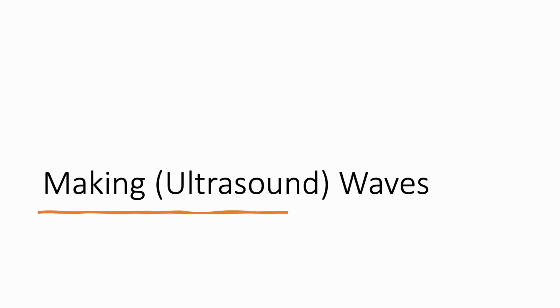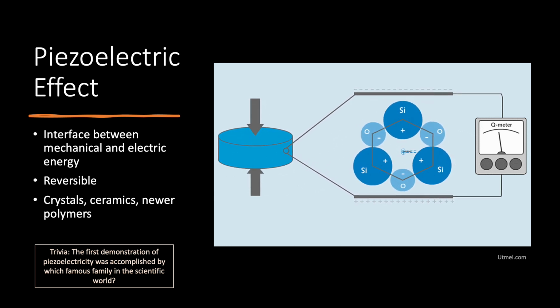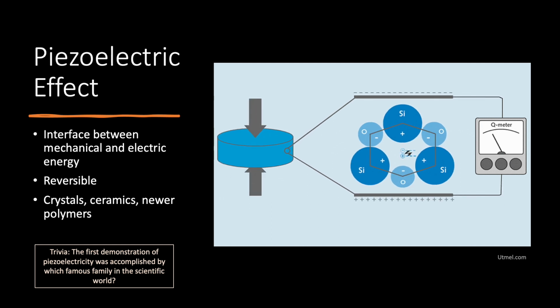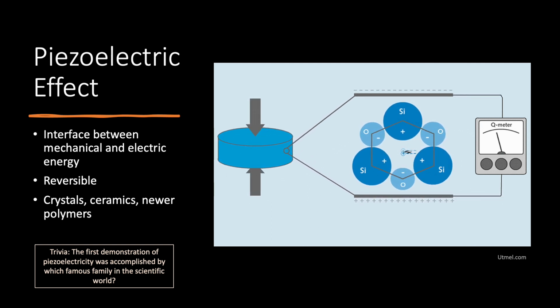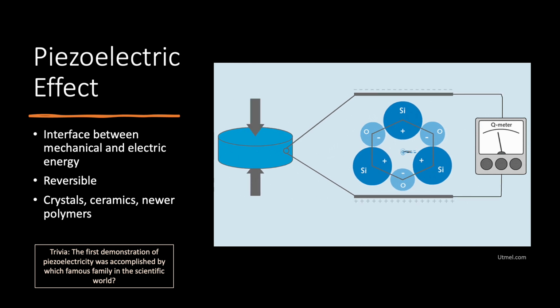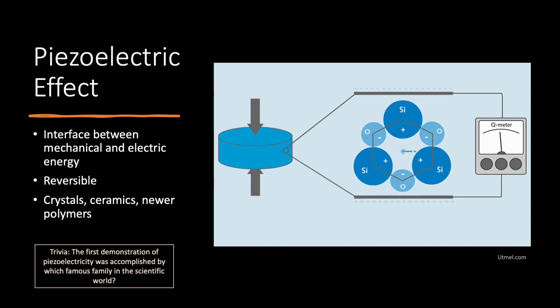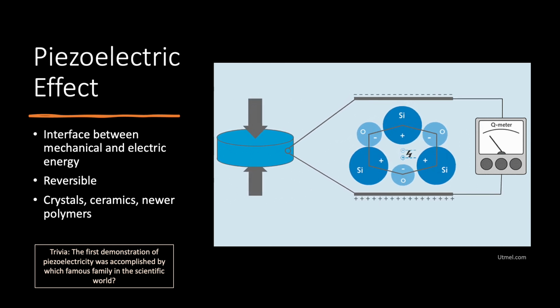All right, so first, let's talk about how we make ultrasound waves and what vocabulary we use to describe them. Generating ultrasound waves relies on the piezo or piezoelectric effect. I've heard it pronounced both ways, and I don't care which one you use as long as you understand it. And the key to understanding it is to focus on the animation that's on the right half of the screen here. The piezoelectric effect is a phenomenon where certain materials, most commonly we refer to these as crystals, but it can also be ceramics or polymers or a variety of different things, react when mechanical stress is applied to them.